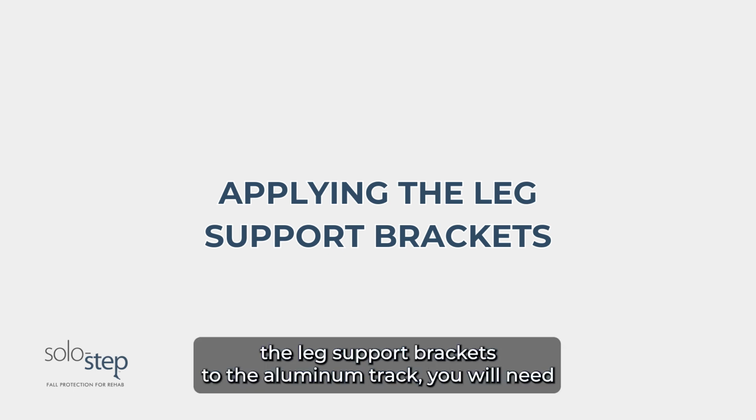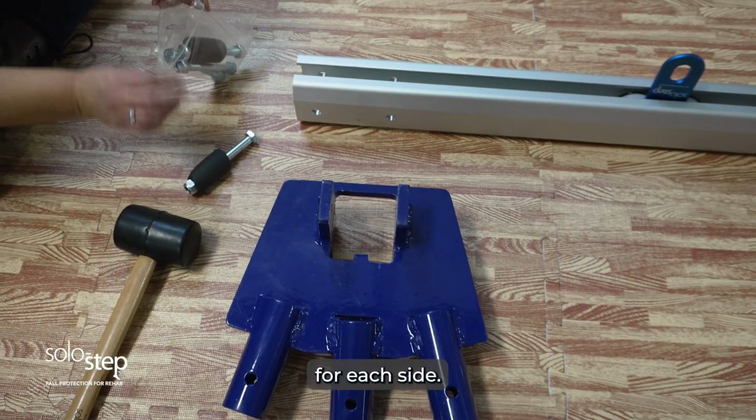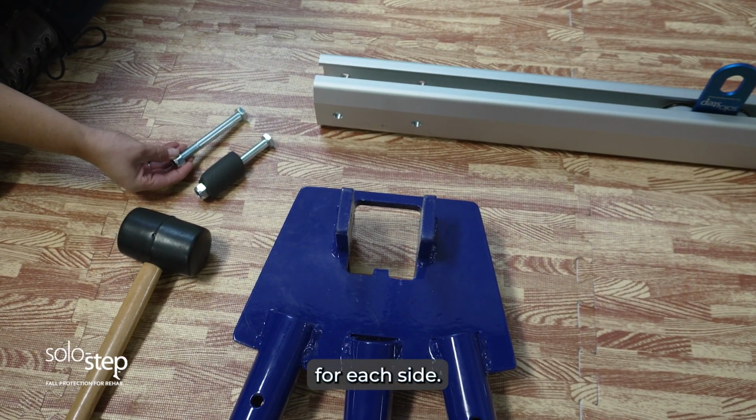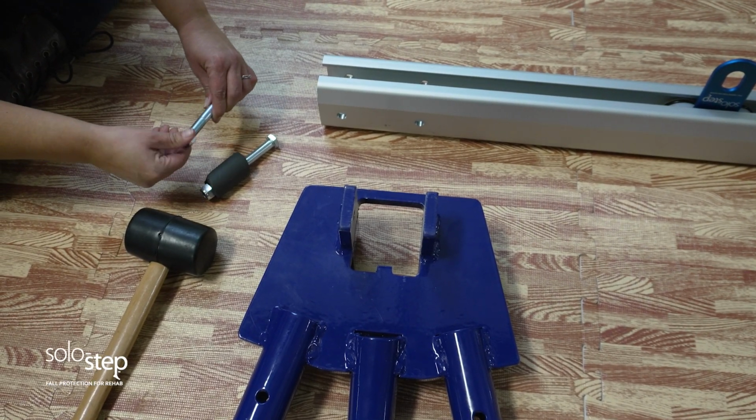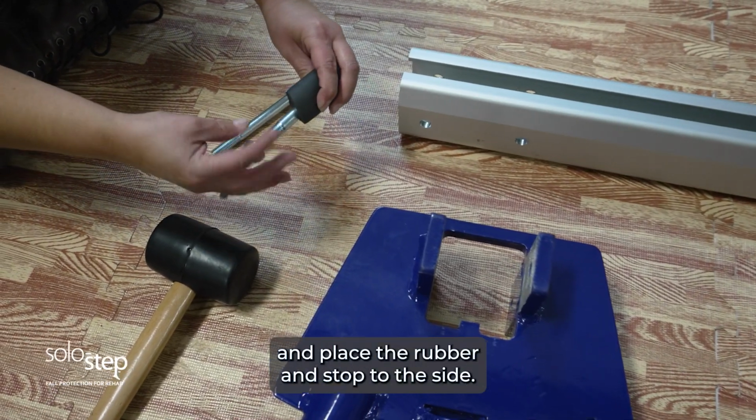To apply the leg support brackets to the aluminum track, you will need the included rubber end stop, 2 bolts, and 2 nuts for each side. Unscrew the nut and bolts and place the rubber end stop to the side.